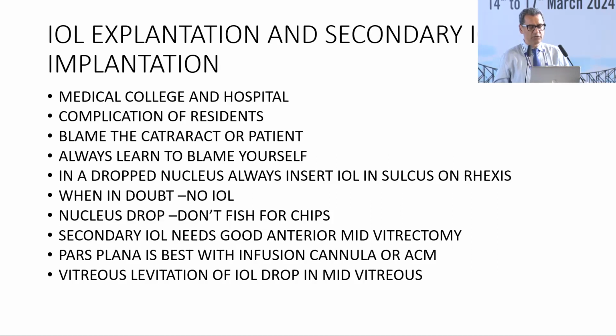When the nucleus drops, please don't fish for chips. Don't go in the mid-vitreous and try to get those things out, because you'll cause a large dialysis and detachment. And a case which is potentially 6/6 with a good vitreous surgeon managing the case becomes a PL patient.